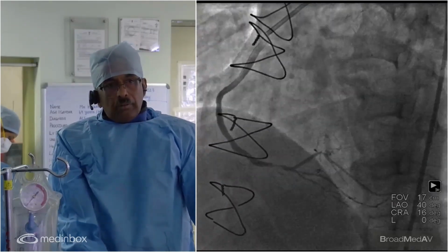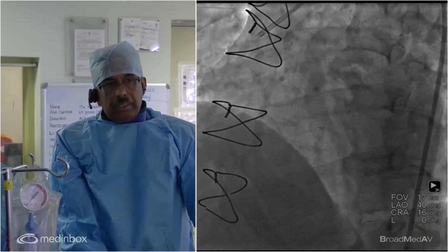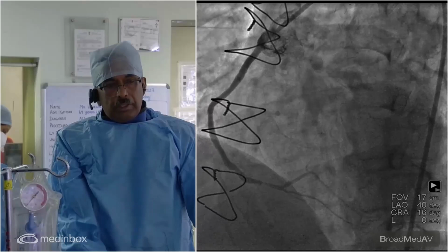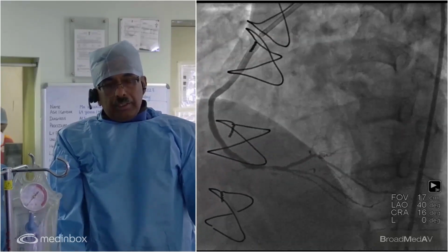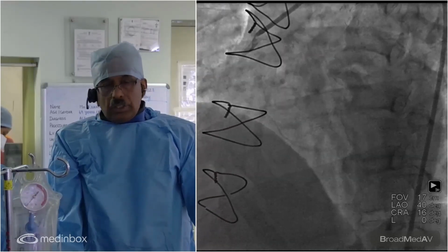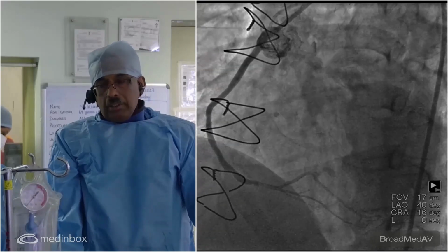The answer is no. We don't have a place to put a protection device such as a filter wire. The filter wire would be useful for big grafts with large atherothrombotic thrombi. Here it's a small distal vessel. We're not going to get any protection device through. And currently, both the European Society and ACC have downgraded the use of protection to 2A.